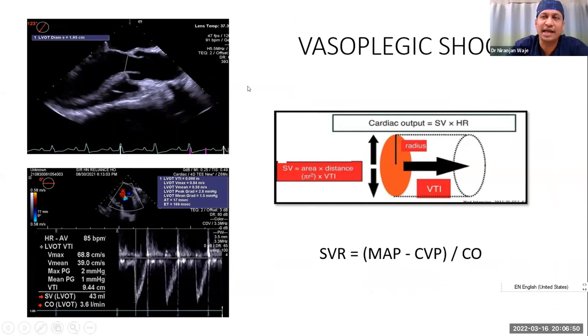Apart from the qualitative assessment, echo can be used quantitatively as well.